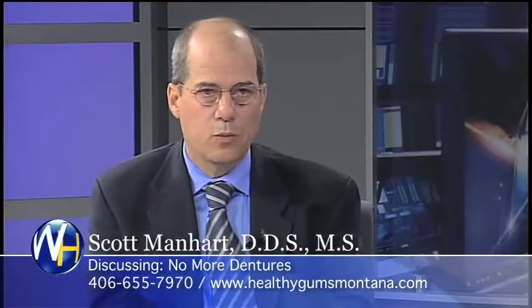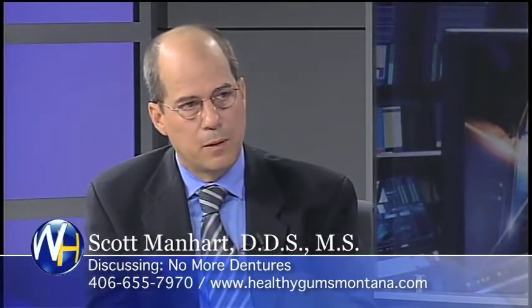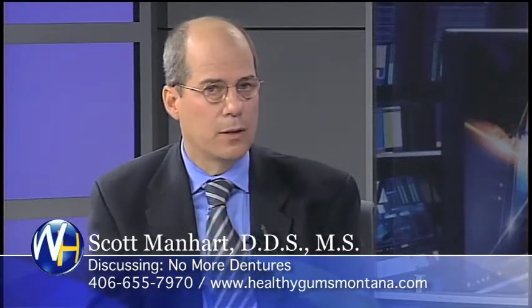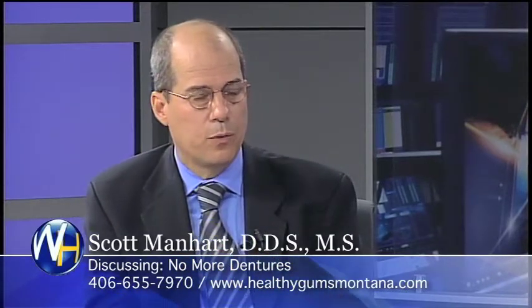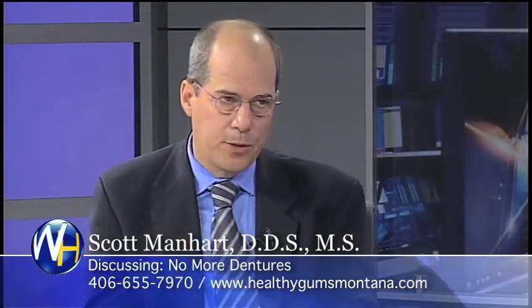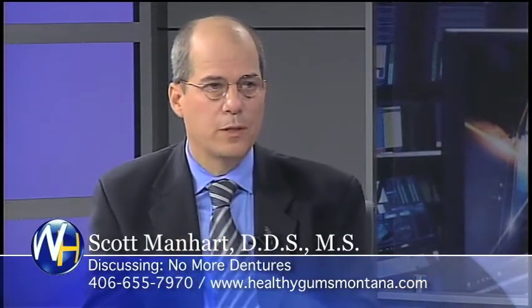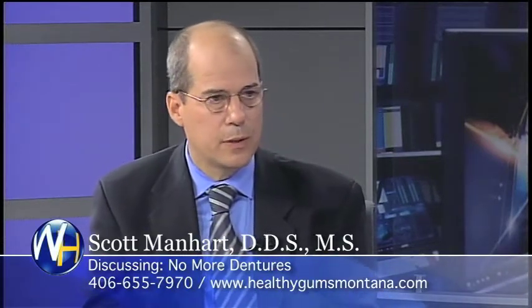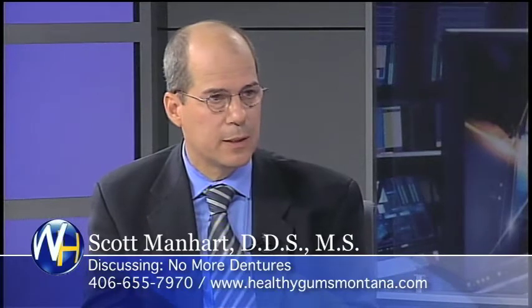Now what about a fixed set of teeth? Like that don't come in and out. Some patients want to get rid of the removable concept completely. In those cases, on the lower arch, we can do that on only 4 because the mandible is very hard bone and it will support that. In the upper jaw, we need a few more just to be sure in case we lose one. So we'll go to 6 usually if we can, 5 or 6, something like this.